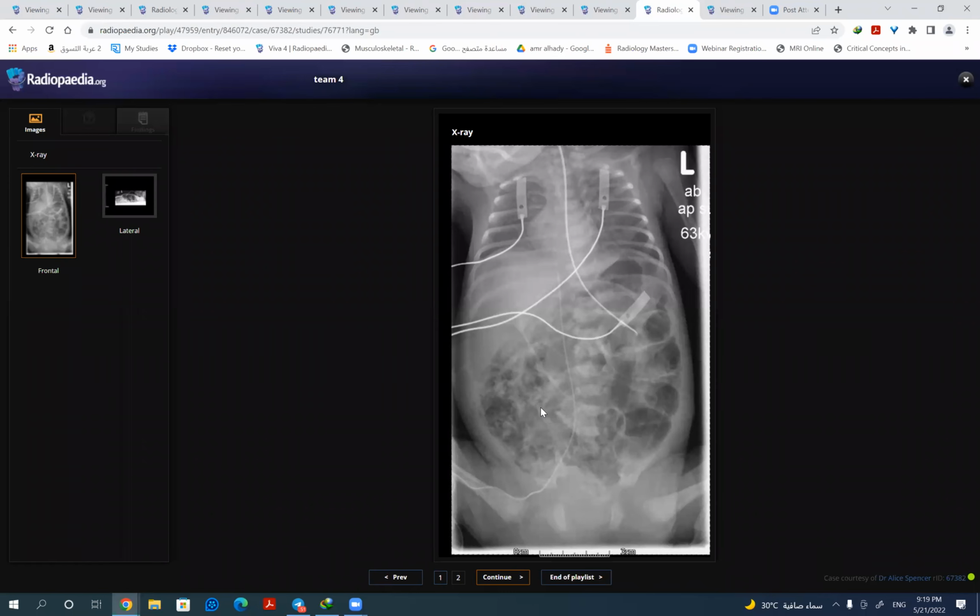And basically, whenever you see pneumoperitoneum or RDS, if you're seeing the chest, you have to comment on the abdomen. If you're seeing the abdomen, you have to comment on the chest. Sometimes the examiner may also ask you what the other associated features can be. Okay, so you'll have hemorrhage in the brain and the other related preterm conditions. So you should be very familiar with the whole spectrum of the disease and be fluent in your terminology. It should just come out automatically because it's a very common exam case. Yes.